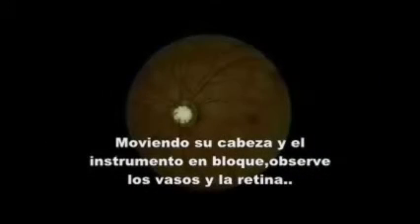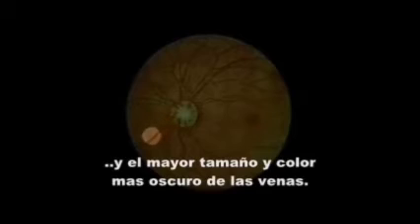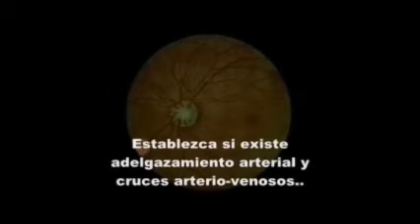Moving your head and instrument as a unit, inspect the retinal vessels and adjacent retina by following the vessels from the disc to the periphery in 4 directions. Note the relative size and color of the smaller, lighter arteries and the larger, darker veins. Look for changes such as nicking of the veins at arteriovenous crossings. There should be none.